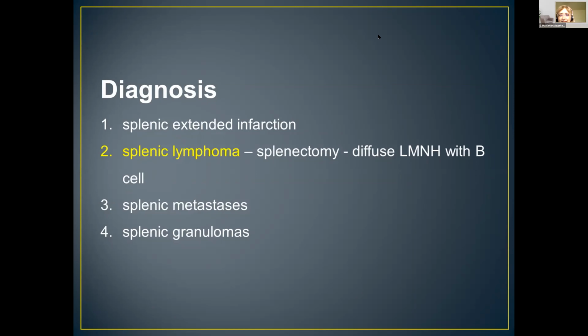Yes, I have a patient with lymphadenopathy, inhomogeneous spleen with multiple lesions. CT scan performed 1 week after contrast enhanced ultrasound said that there are no lesions in the spleen. I saw again the patient, and the lymph nodes had almost disappeared, and the splenic lymph nodes were reduced in size.